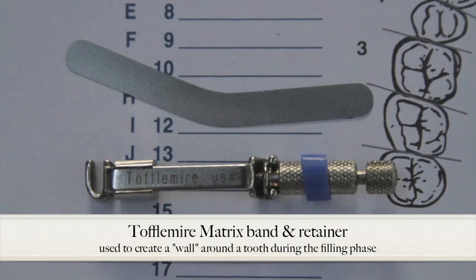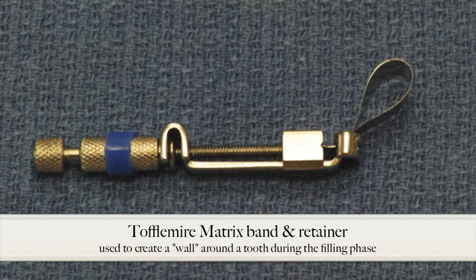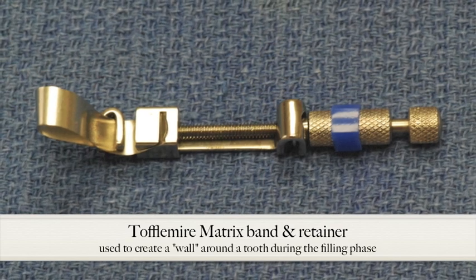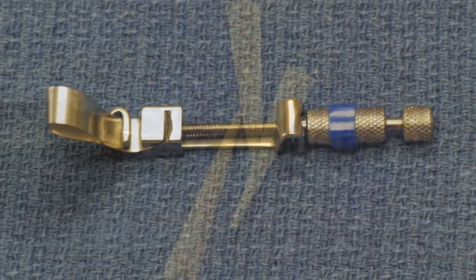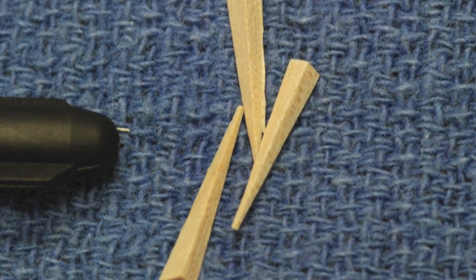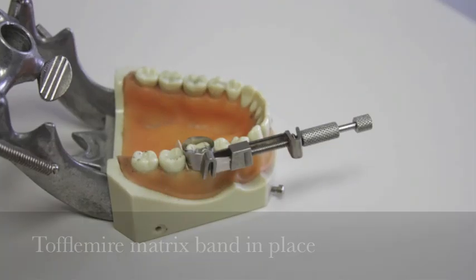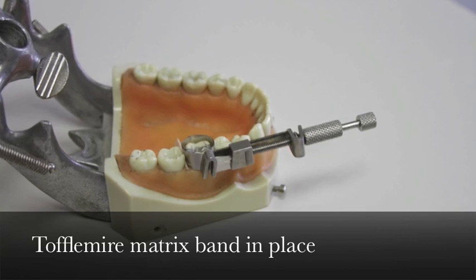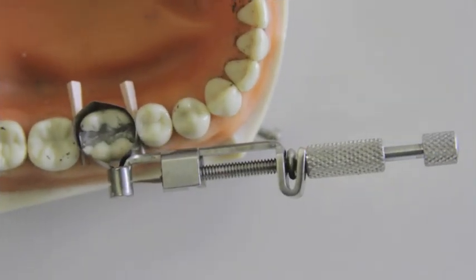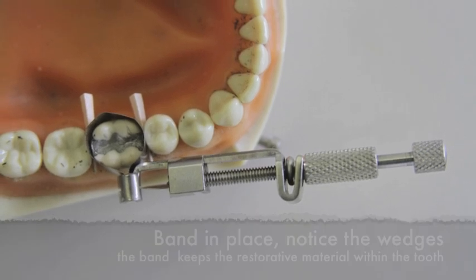What you see here is the Tofflemire matrix band and its retainer. This is one of many varieties of systems used to create a temporary wall around a tooth to allow a restoration to be placed, keeping the restoration material within the confines of the tooth. A partner to the matrix band is the wooden wedge — a piece of wood or plastic used between the teeth to force the matrix band tight against the tooth. It also slightly pushes the adjacent teeth apart to compensate for the thickness of the matrix band, since it is very important for the teeth to be in contact with each other after the restoration is completed.